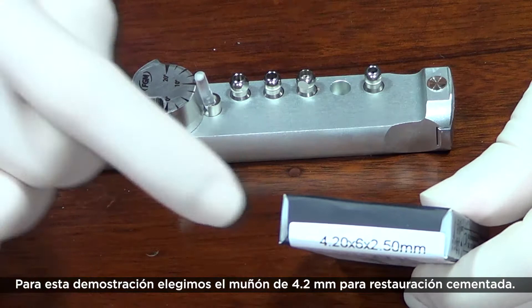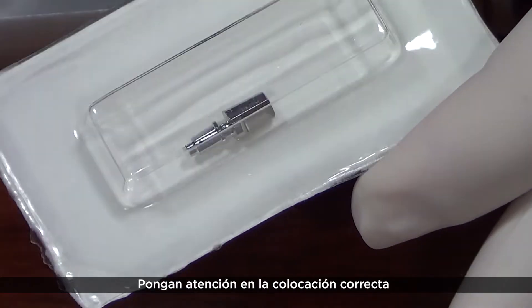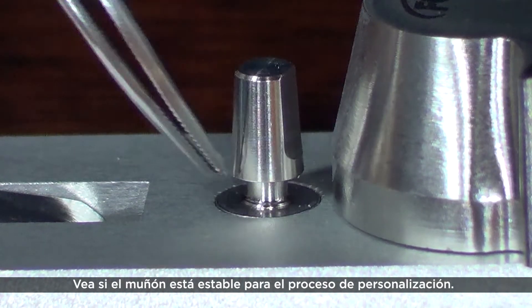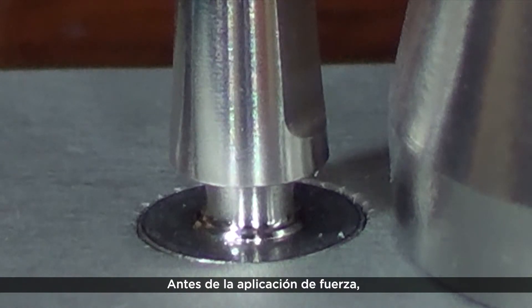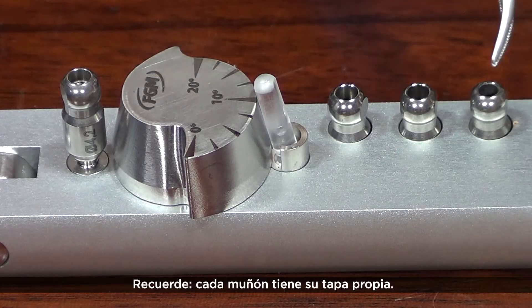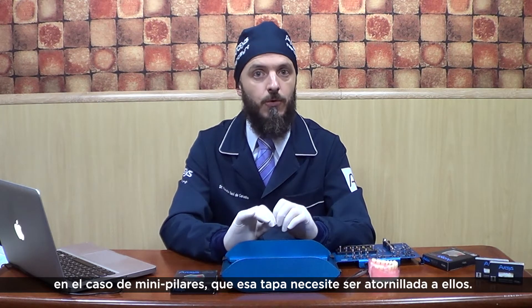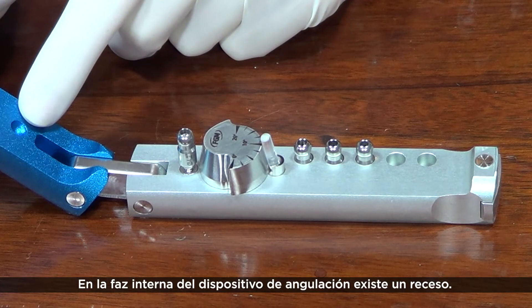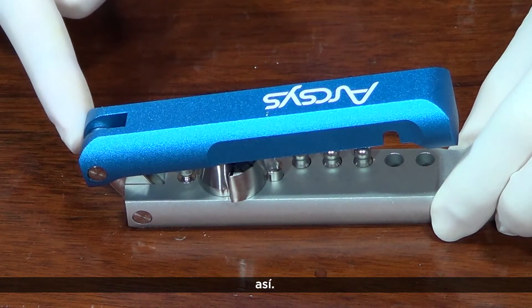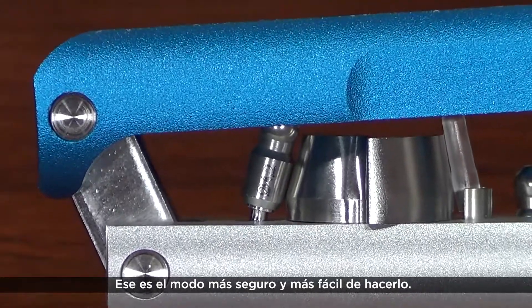Now we are ready to perform the abutment customization. For this demonstration, we select the 4.2mm abutment for cement-retained restoration. Pay attention to the sacrifice ring settlement at the folding device — it should guarantee abutment stability during the customization process. Before applying forces, it must be protected by the metal cover. Remember, each abutment has its proper cover. In case of mini-pillar abutments, the cover needs to be screwed over them. In the abutment folding device internal face, there is a semi-lunar hole — this groove should be positioned over the abutment cover. The compression is applied on the angulator extreme — this is the safer and easier manner to do that.